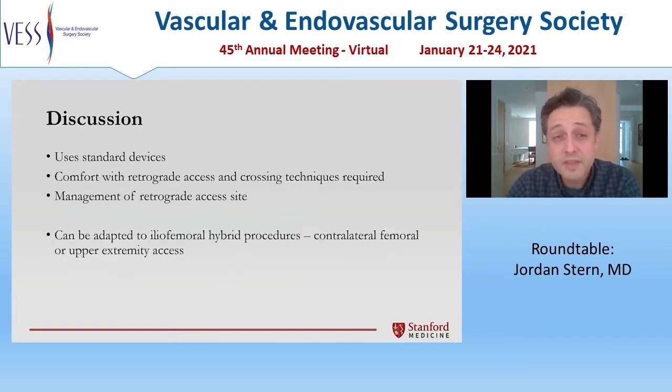One advantage to this is that it uses standard techniques and standard devices that are all familiar to us. However, the technique does require some comfort with retrograde access and crossing techniques from below. Once again, management of the retrograde access site is required, and this again would default to the operator's primary practice when using pedal access in general.